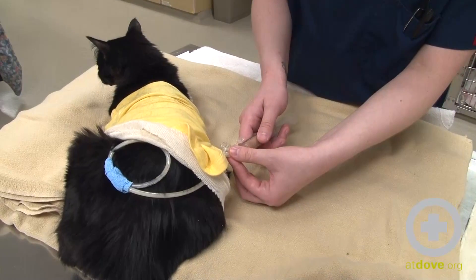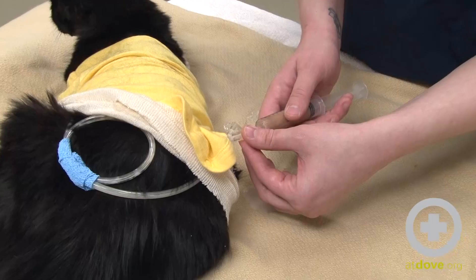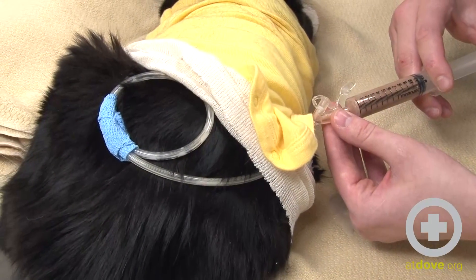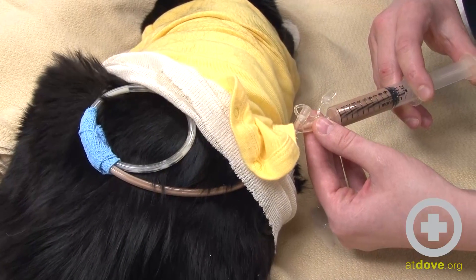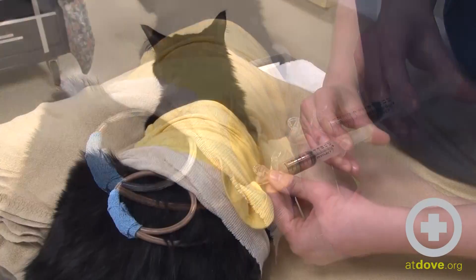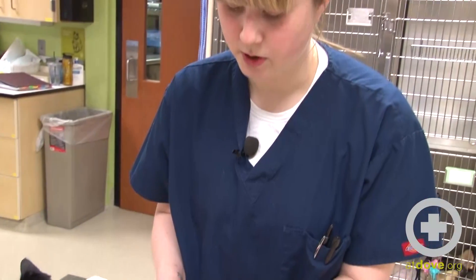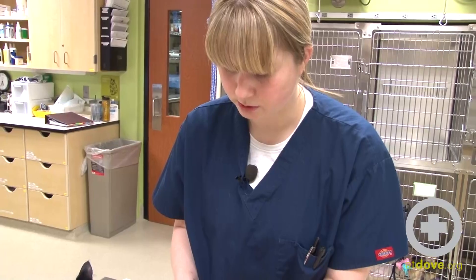I'm going to attach the syringe here. You will sometimes get pressure from the stomach contents pushing back a little bit, which is where that fluid just came from. I have about five to six milliliters just to fill the tube, so I'm going to push that slowly into the tube, but a little quicker than once I give her the feeding when it's at the stomach. So I'm six milliliters in — I have all of it within the tube, so now is when I'm going to start the slow, steady push of it hitting her stomach, starting with about one milliliter to see how she responds.